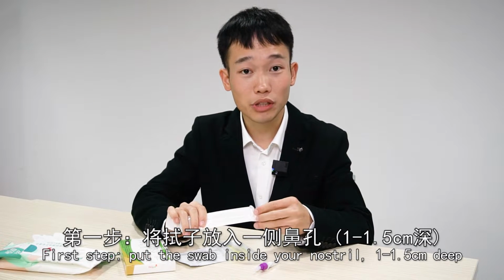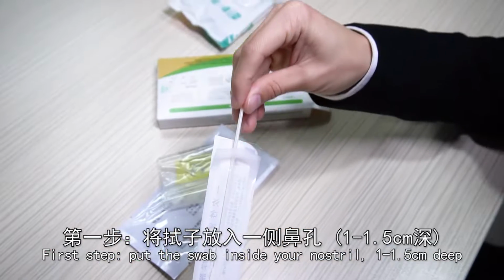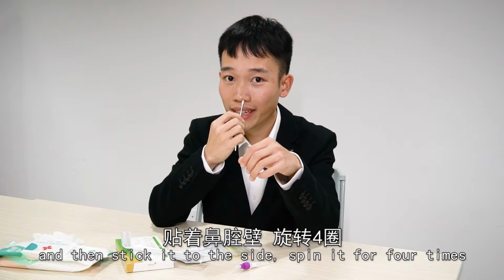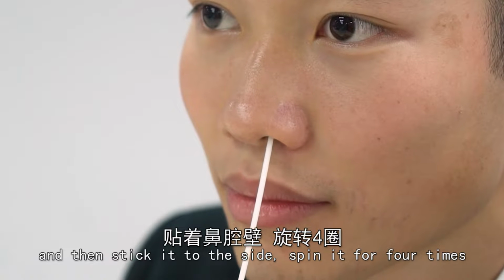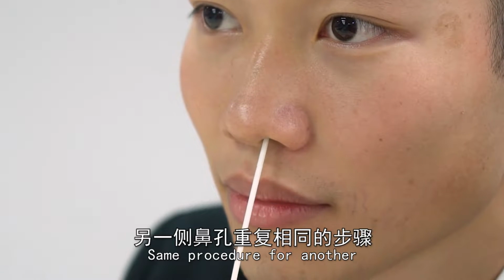First step is put the swab inside your nostril. So here is the swab. And then stick it to the side, spin it for 4 times. Same procedure for another.